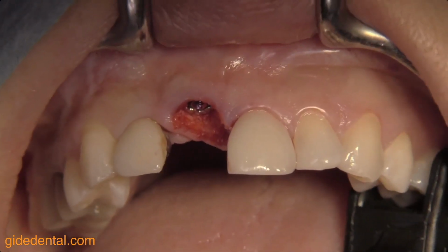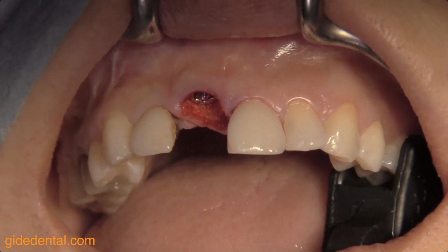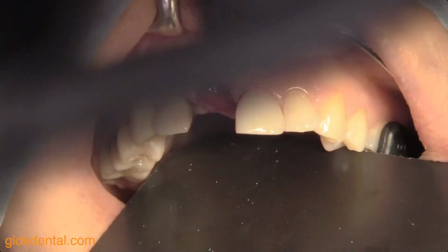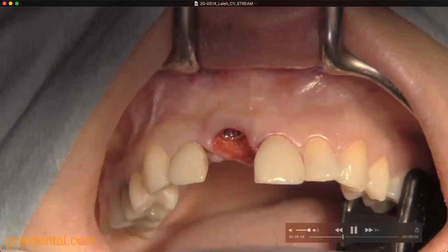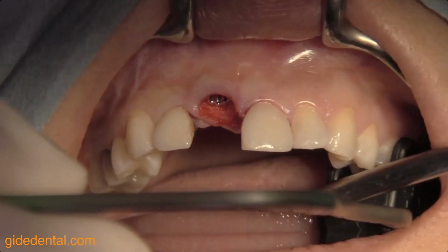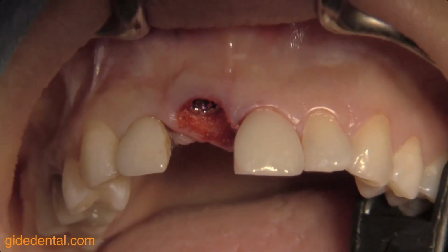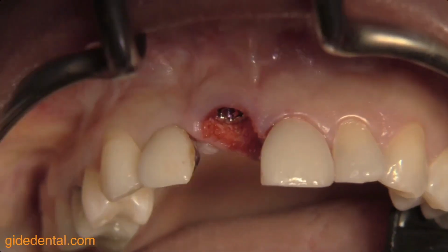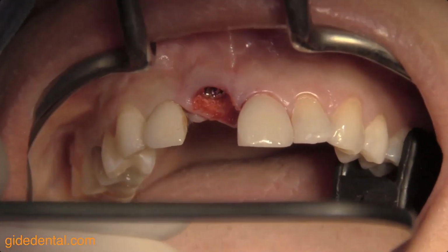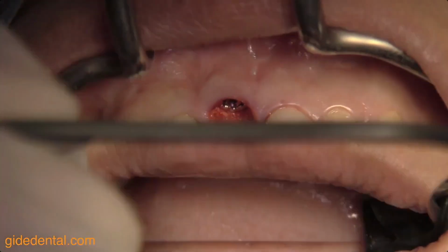And it's a stock abutment, so it's pretty easy to order this. And all the custom work will come on top of this. But it's a stock abutment, so it's not custom. So that means that you need to have a little bit more space. It doesn't function really well in narrow spaces. So I wouldn't probably use it for lateral incisors or for lower incisors. But for a pretty normal width central incisor, you could use it. And of course, like for premolars, you could use it. Here's the visual.